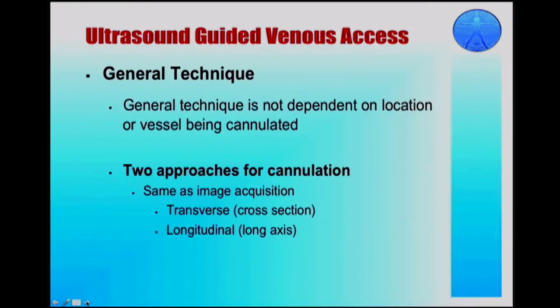Now, the general technique for ultrasound-guided venous access does not depend on the vessel being cannulated. And there's two approaches for cannulation, and they're the same name as for image acquisition, so transverse or cross-section and longitudinal or long axis.